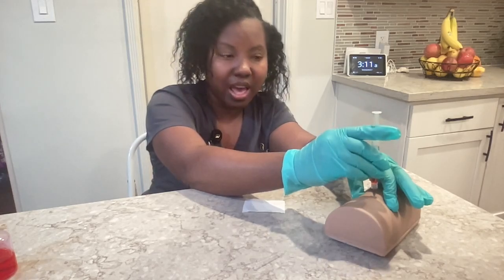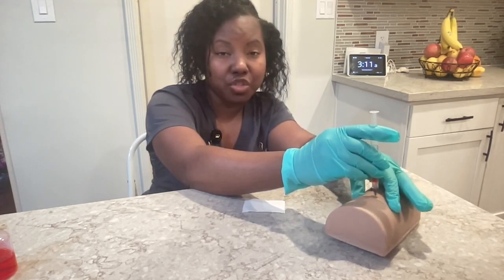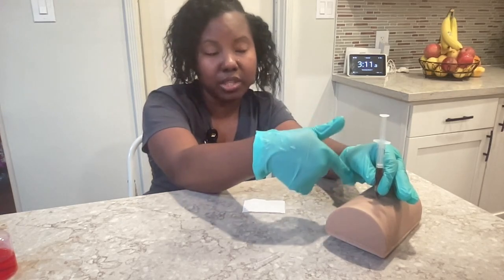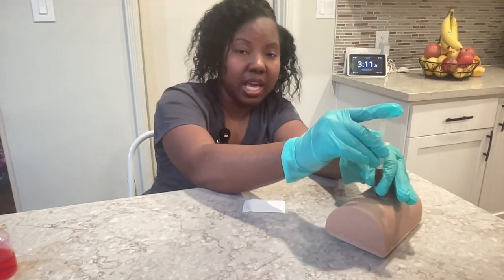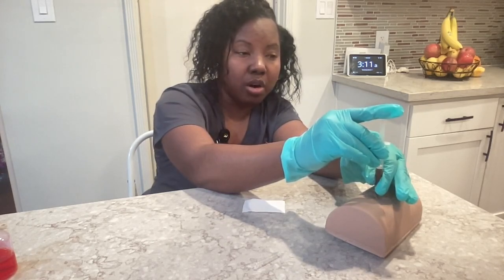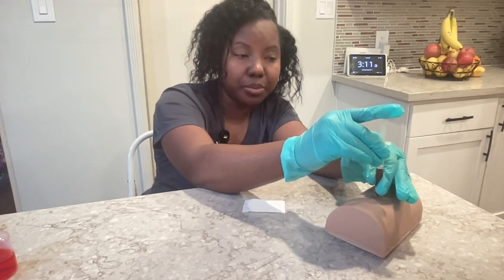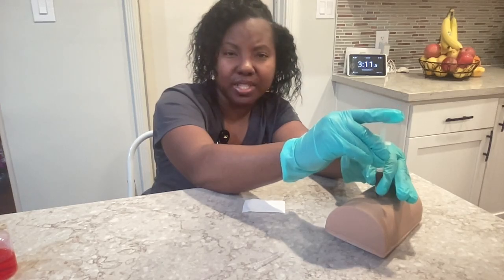Now that the needle is inserted, I am going to move my two fingers that were stretching the skin and place them at the bottom of the syringe. I'll keep my ulnar side holding the area down, and then with my dominant hand I am going to inject. When injecting the medication, you want to do it at about 10 seconds per milliliter, so I want to do it over about 15 seconds.